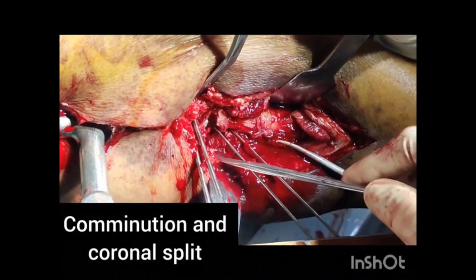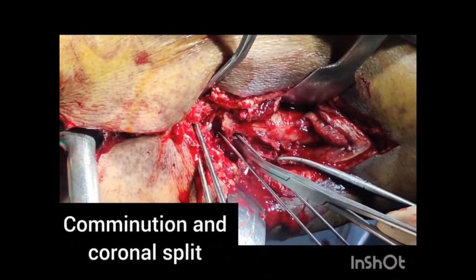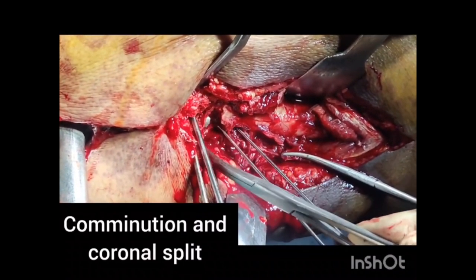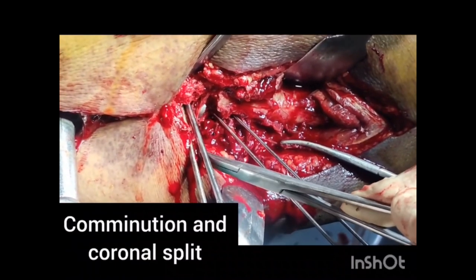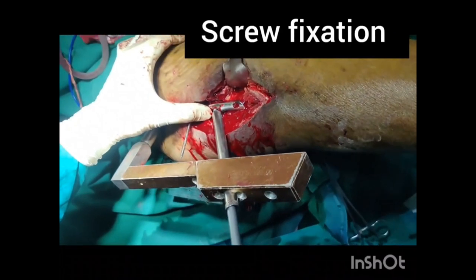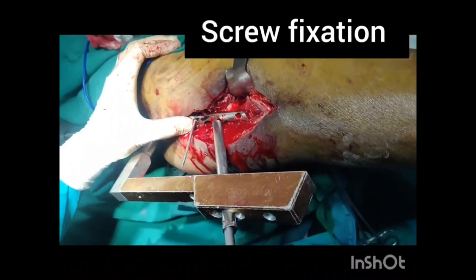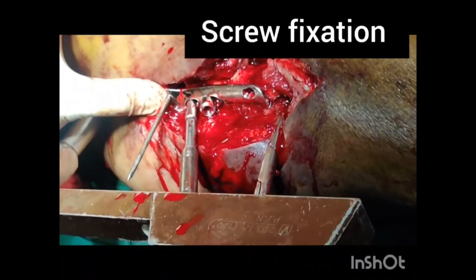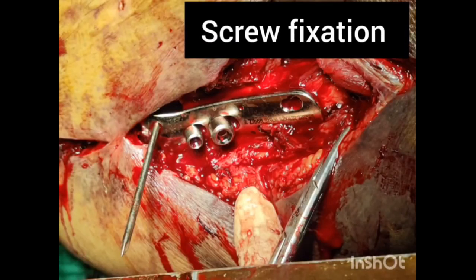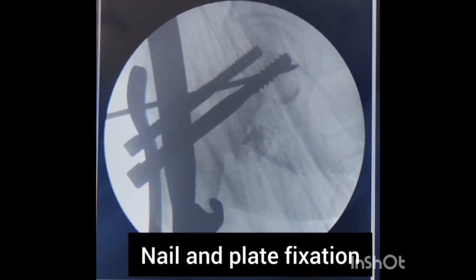In such a situation with a coronal split, nail fixation often fails even though it looks good on x-ray. You can see the bare proximal part of the nail. The plate is then placed over those guide wires, and through the jig, stabilizing and inferior screws are passed so the plate fits snugly against the greater trochanter. Through this plate, the screws not only fix the head-neck fragment but also buttress the lateral wall.